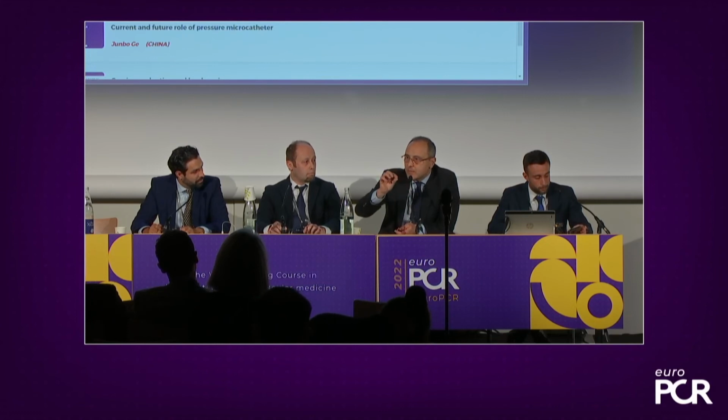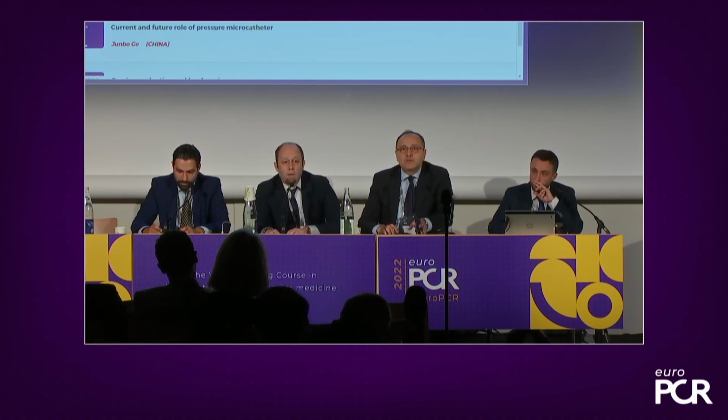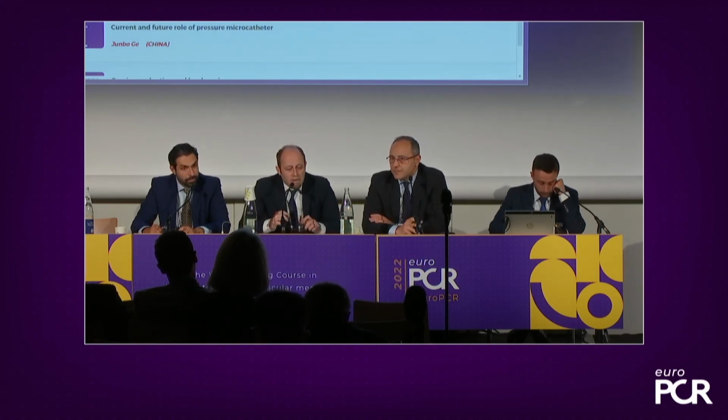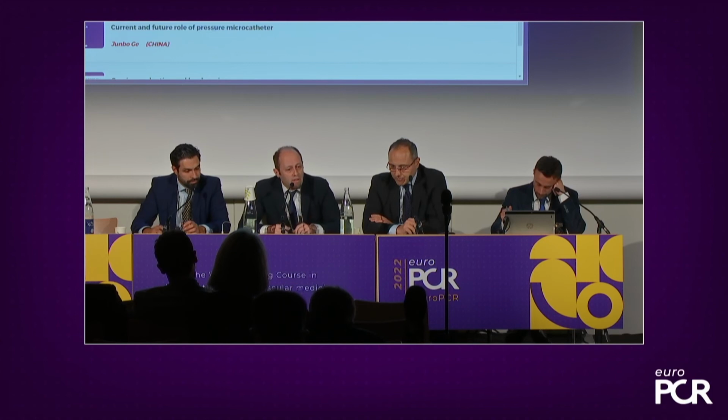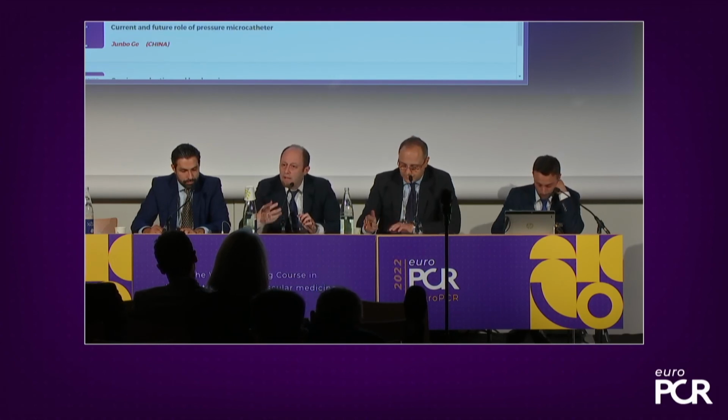But we ended up with 2-3 millimeters mercury drift after a procedure of 1 hour and something. So it's quite good. By the way, if there is anyone who wants to comment, or otherwise, Emanuele, I can ask you a comment about residual diffuse disease after stent implantation, because I believe it's a very important message for all the people that it is not a failure of PCI technique.